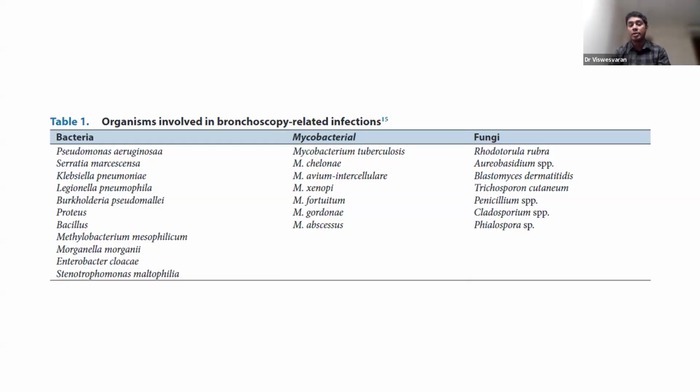And if these organisms are introduced into your patient and cause an infection and possibly a disease, then it's going to be extremely difficult to eradicate these organisms from your patient. So safety is of utmost importance, not only for the patient, but also for your scope as well as the healthcare personnel handling these high-end equipments.